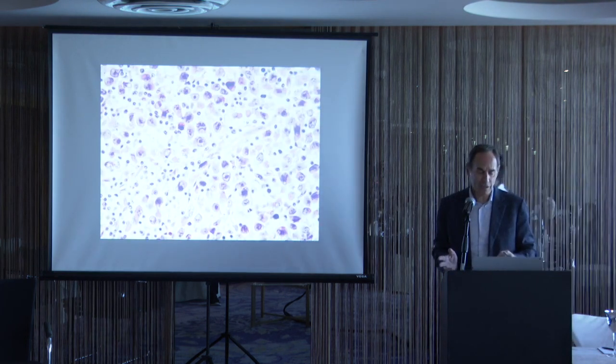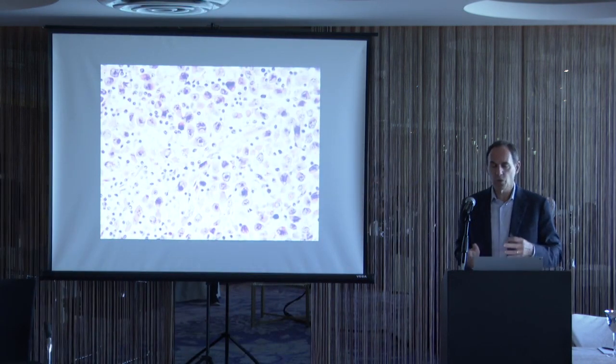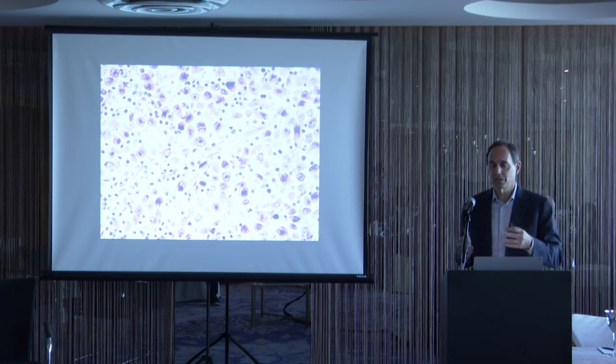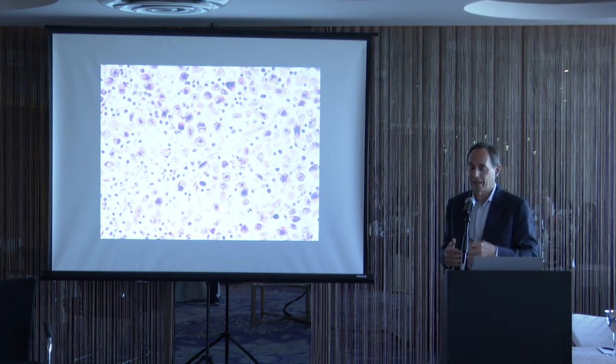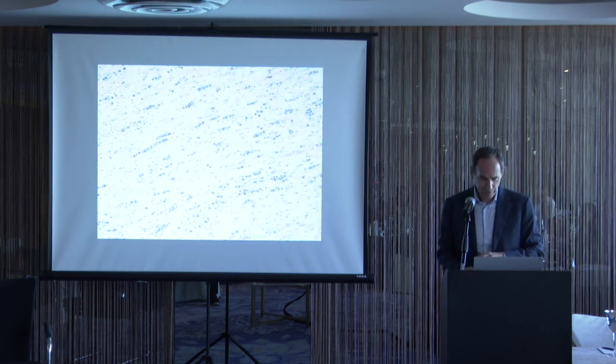But here we see an example of what in the past was called anaplastic seminoma. We don't use that term anymore because stage for stage, these seminomas that look more pleomorphic have the same prognosis as usual seminomas. But they are more difficult to recognize because they do have a much greater degree of pleomorphism than the typical seminoma. Cells are still loosely cohesive, in contrast to embryonal carcinoma.